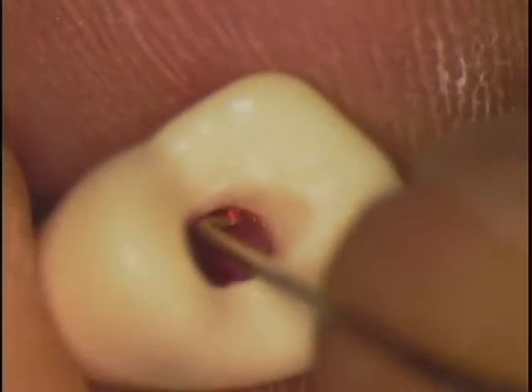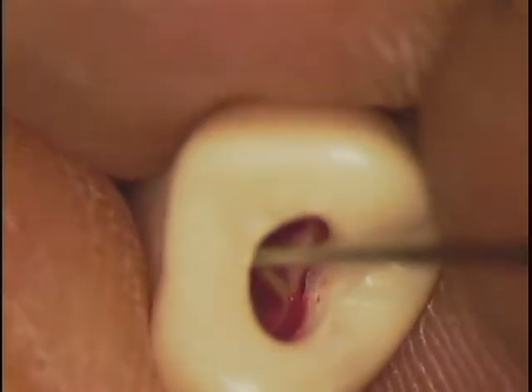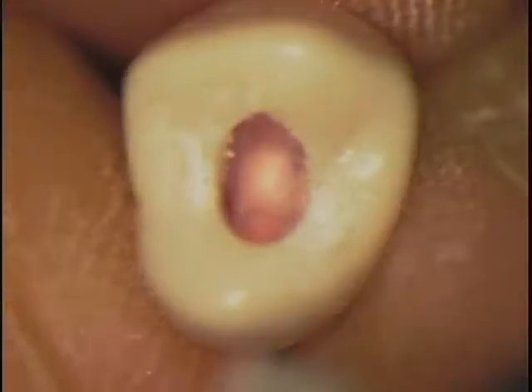See, I can still almost, well, actually that feels pretty smooth right there. That's pretty smooth. That's the buccal. Here's the distal. I got a ledge on the distal. And I got a little ledge on the mesial. So I'm going to just take my burr and very gently go in there. It's almost like you're an eye surgeon now, right? And just smooth that wall a little bit. And come in here and smooth that wall a little bit. Okay. I think that's pretty good.